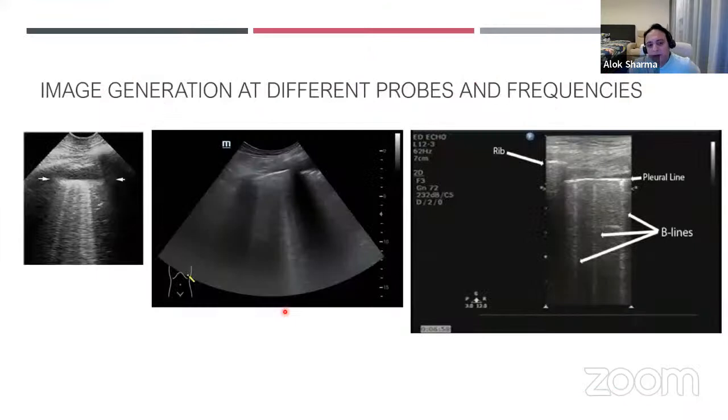And for me, the important aspect when you're describing your lung ultrasound is that there's a learning curve. But if you can show me the bat wing appearance, pleural sliding, and interpret what you think of the lung in terms of visible A and B lines, that's all I want to see in the next 2 weeks. I am quite happy for you to learn profiles as time passes by. I think if we can just describe what the normal bat wing sign looks like in a normal lung, what A lines and B lines look like, and your interpretation of what kind of B lines you see in the context of the probes that you're using, we're looking at pattern recognition at this particular stage.